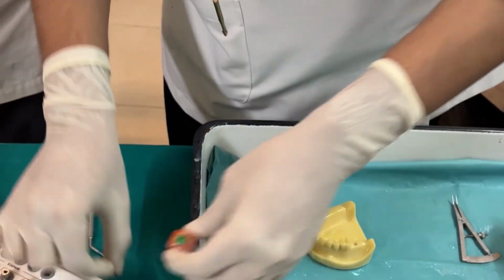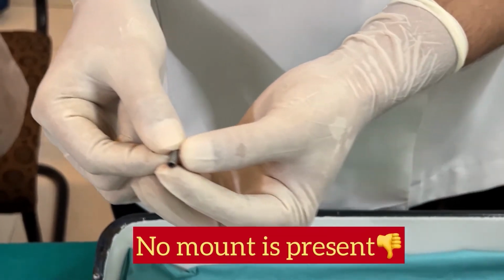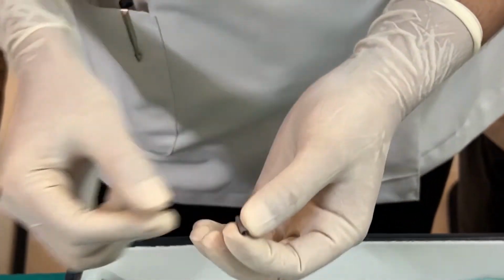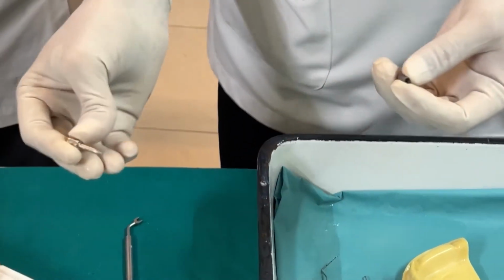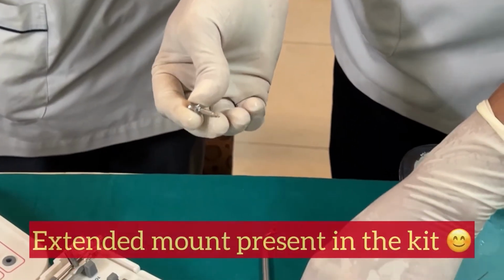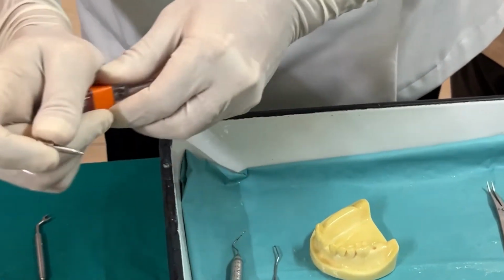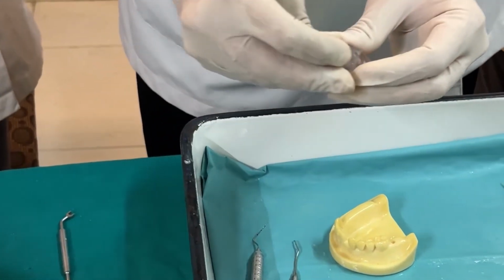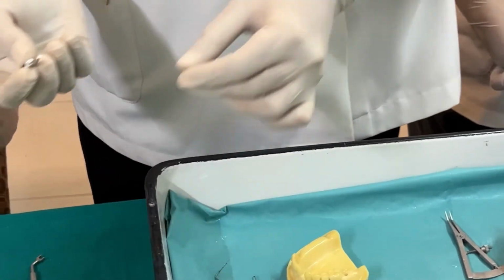It basically comes as an implant which doesn't have a mount inside the packet, right? So we have to use our custom mount or the stock mount that we have in the kit as such. So this is the mount or the extended mount that we have to use for engaging the implant from the implant packet. Okay. So the rule is very simple.